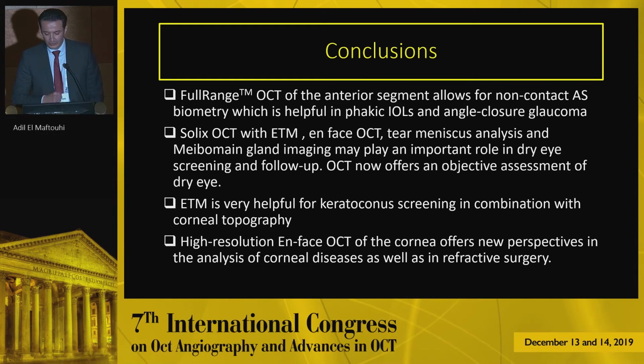ETM is very helpful for keratoconus screening in combination with corneal topography, especially in forme fruste keratoconus, and the high resolution of en-face OCT of the cornea offers a new perspective in the analysis of corneal disease as well as in refractive surgery.